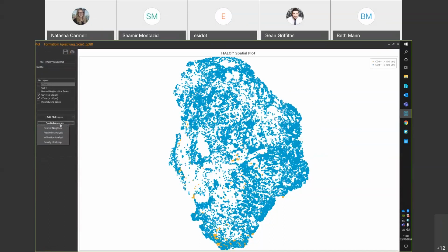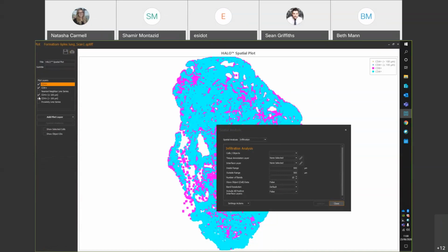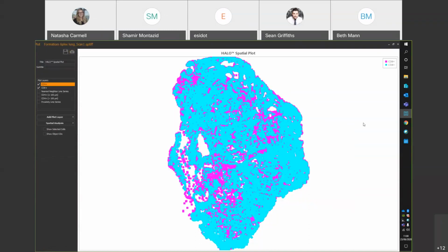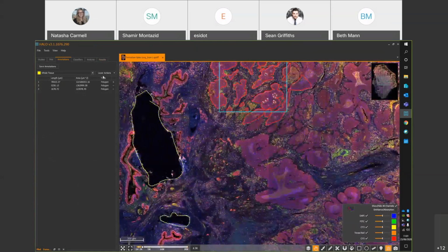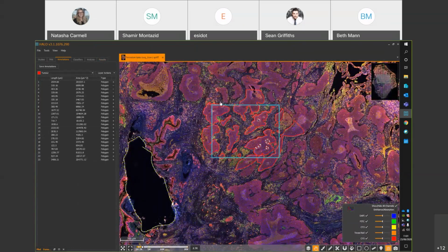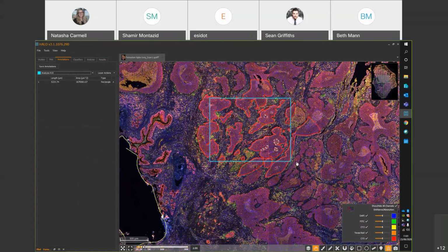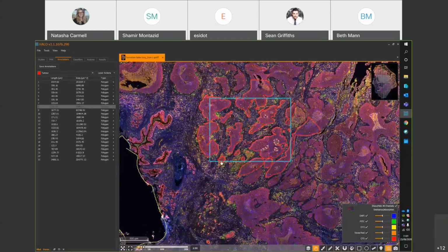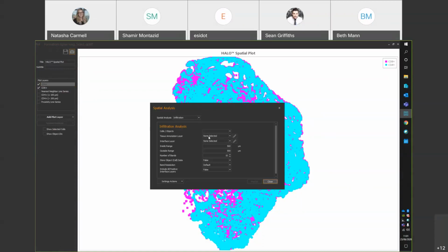So the last thing to do for spatial analysis is our infiltration analysis. And now the reason I left this to last is because we need annotations for this particular analysis. And what I prefer to do is draw my annotations within the annotation tab here. So here, for example, I've got my tumor, which is maybe my invasive margin or tumor border. So that's been drawn in red. And then I've also got the ROI for the analysis, so the region of interest. This, of course, could be a whole slide, but you do need that region of interest in order to fill in the different options for the infiltration analysis here. So you do need that tissue annotation layer, which would be the ROI or the whole slide, if you so wished, but you do need that to define where your infiltration analysis is going to take place.